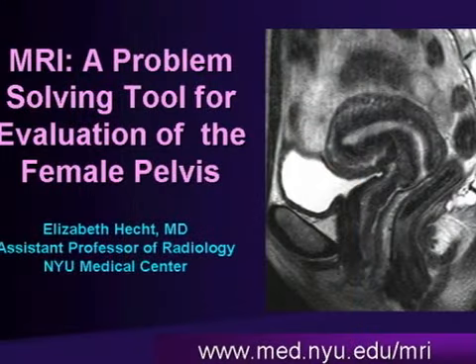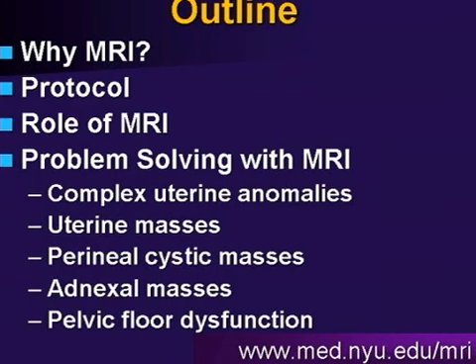So first I'm going to talk about why MRI for the female pelvis when ultrasound continues to improve daily. What role do we have for MR? What our protocol is, some technique advice, as well as to go through certain cases where MR was useful to us, certain clinical cases, and to present some applications of evaluation of the female pelvis with MR.